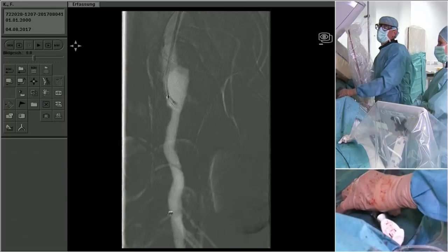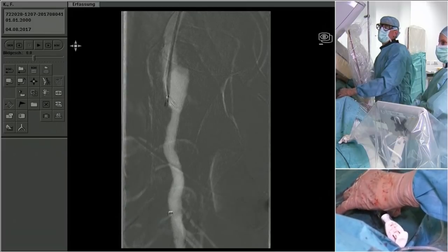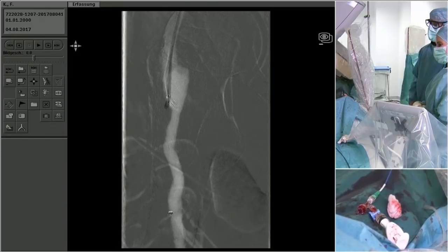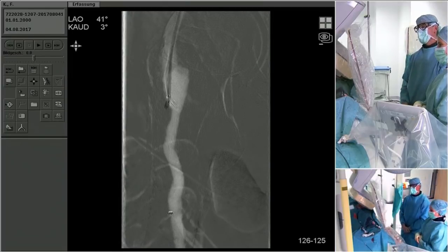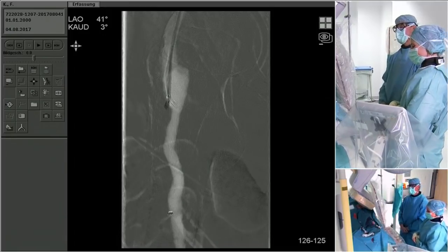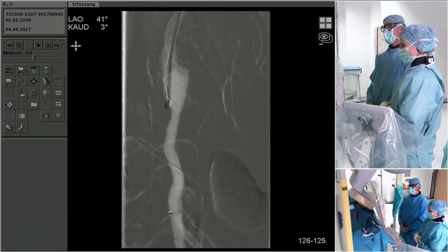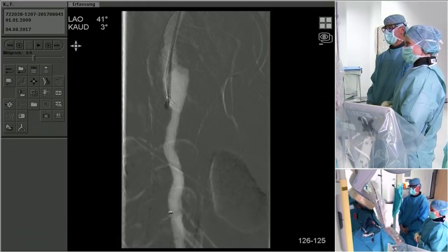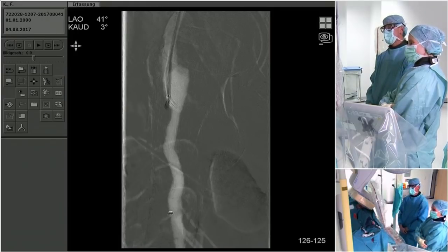Munier, you are the surgeon. Does it look like? No, actually, I will go a little bit higher, Andrej, because it looks like the end of the graft here. If you take more angle, a different angle, it might show it better. Yeah. But can you see, according to the femoral head, it's relatively deep already, isn't it? Yeah, but they are overlapped, so you need to separate them as much as possible.